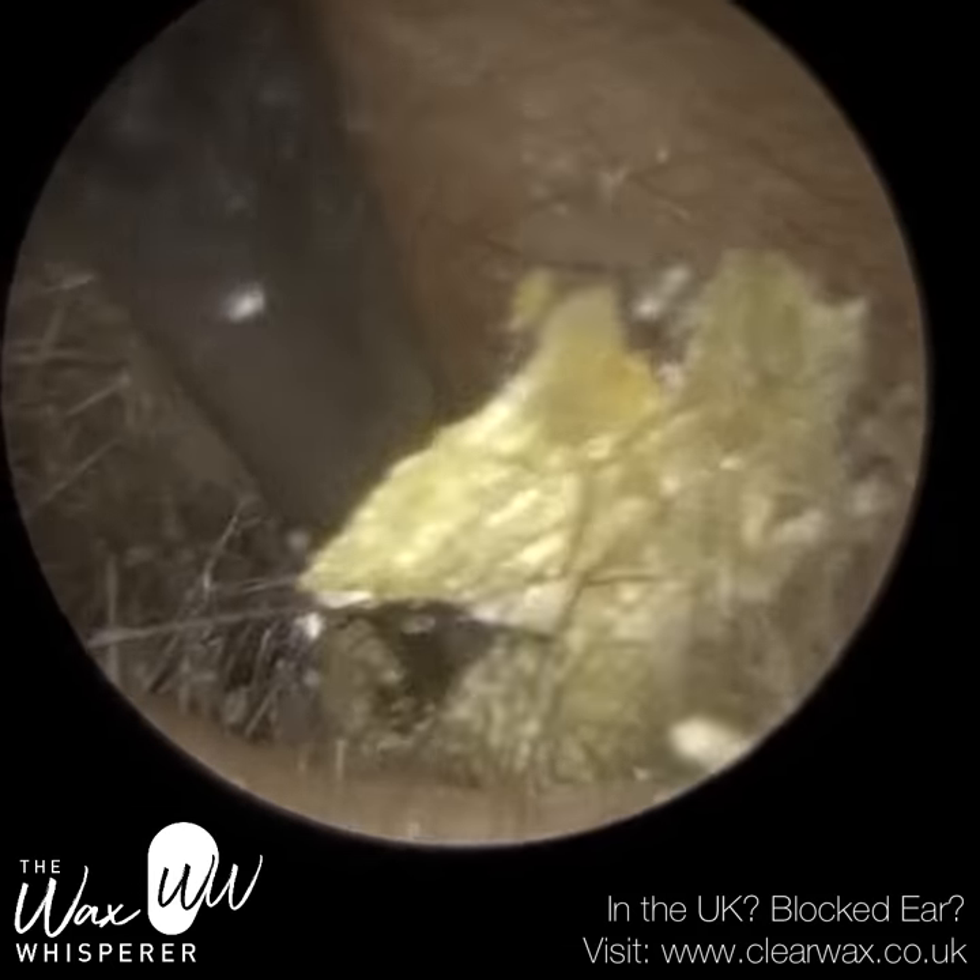And that's all the wax and dead skin. You can see some of it is pitch black — that's the older segments which have oxidized. I decided to put it next to a pencil and you can see side by side it does tally up. Well, I hope you enjoyed that video. Take care, keep well, stay tuned — I've got loads more videos to upload in due course. Thank you, bye.